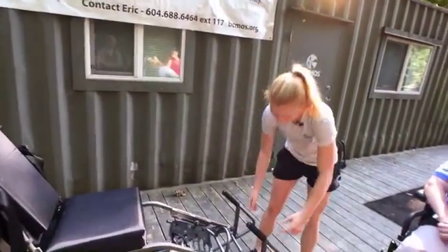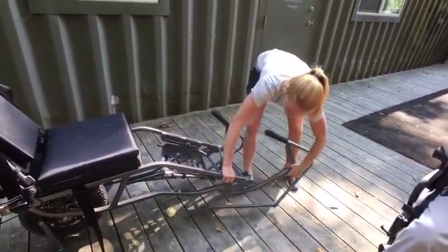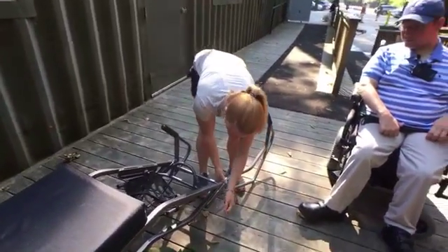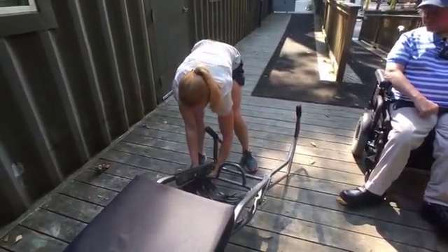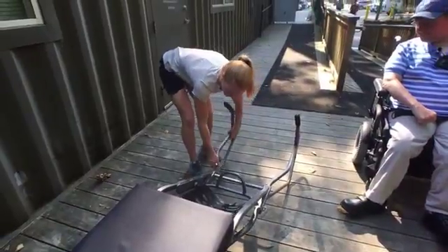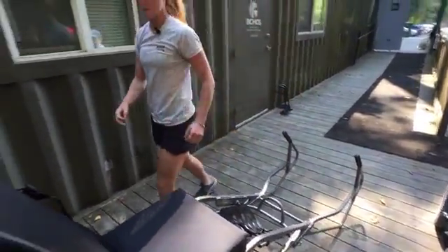The last main thing to do is extend these. So this is where our volunteers are going to hold on, our Sherpas, so that they can help carry and pull the Trailrider. Just like that. And then we also have some armrests as well.